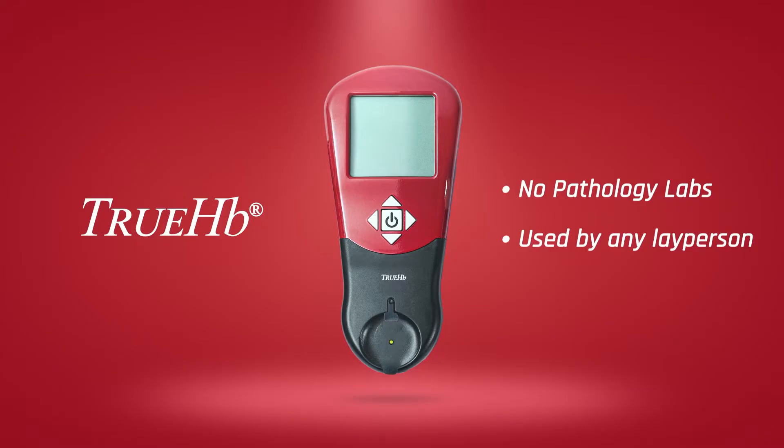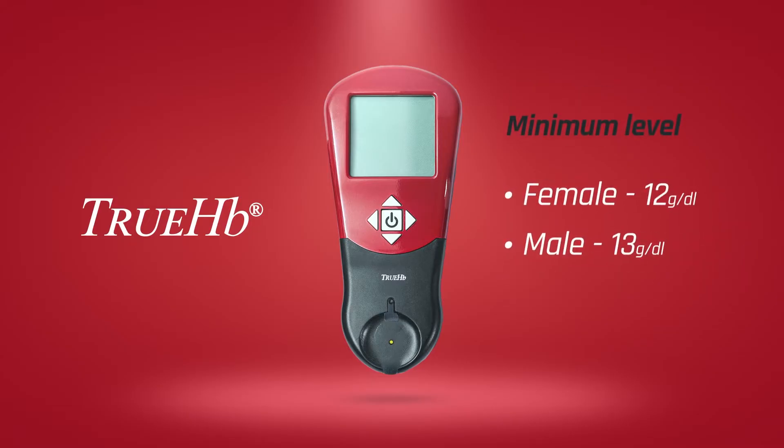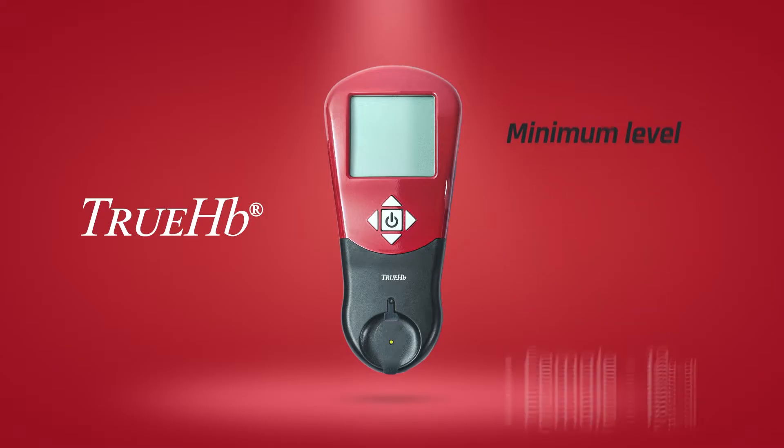TrueHB hemoglobin meter can be used by any layperson at home to monitor the hemoglobin, which minimum for females is 12 g/dL, and for males is 13 g/dL.